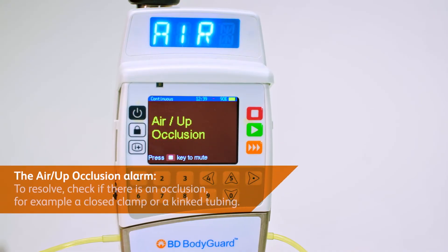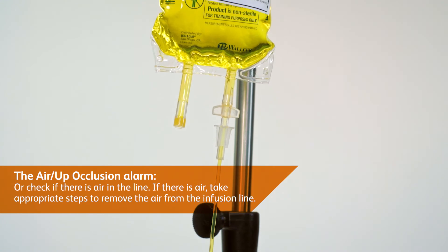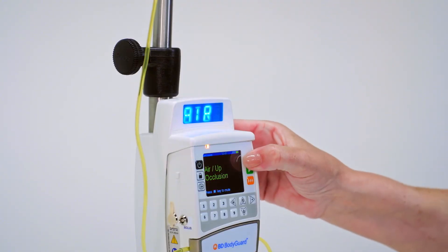The air up occlusion alarm signals there is air in the infusion set, or an occlusion above the pump. To resolve, check if there is an occlusion, for example a closed clamp or kinked tubing. If there is air, take appropriate steps to remove the air from the infusion line.